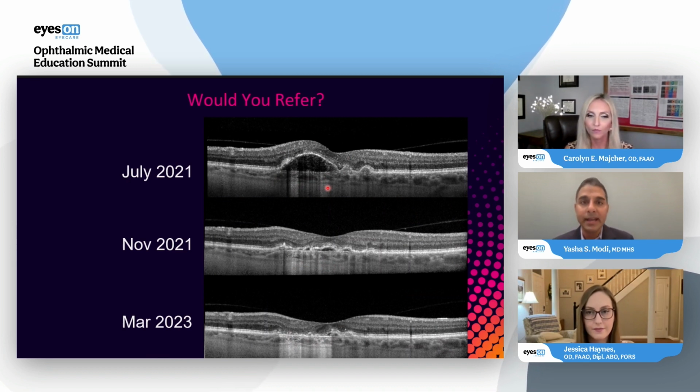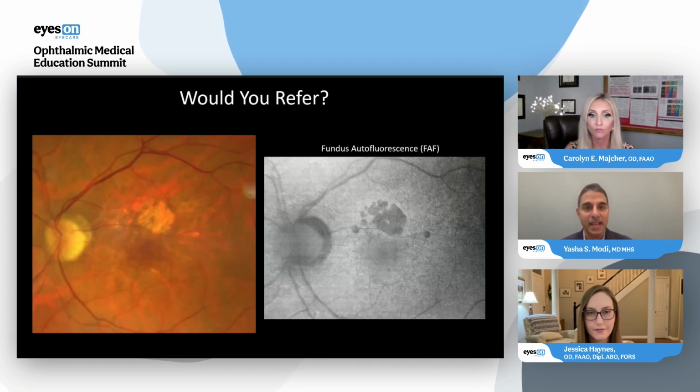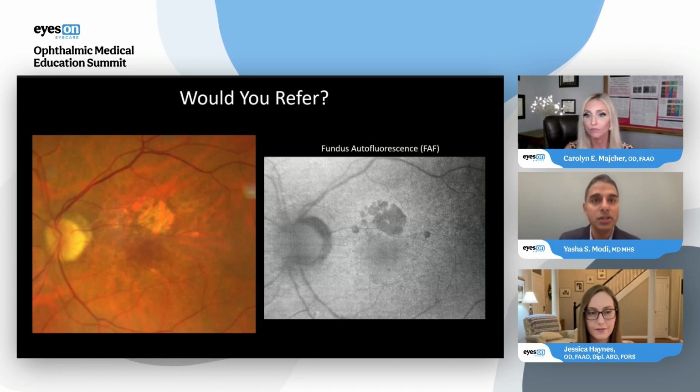But before we get into that, I think, Dr. Majcher, maybe why don't we go on to the next polling question, because I think we want to get your input on these cases. So here, Dr. Majcher, do you want to describe the images?